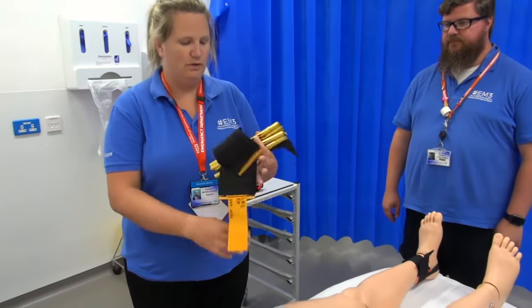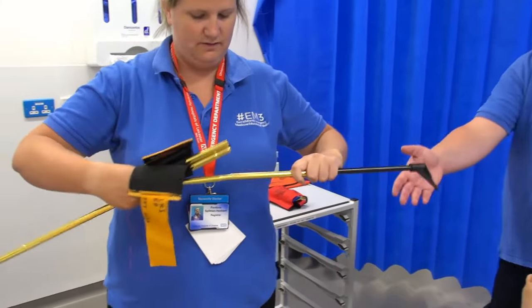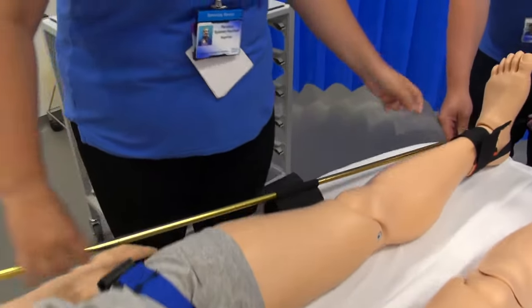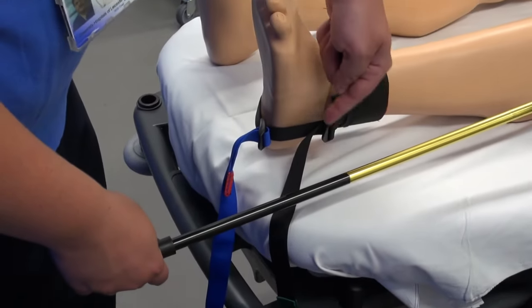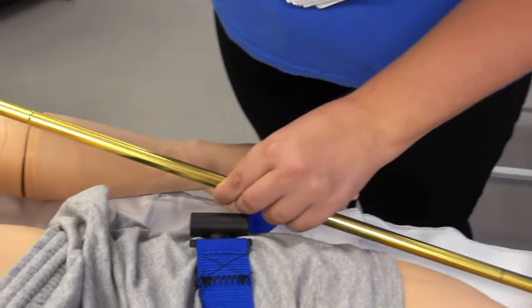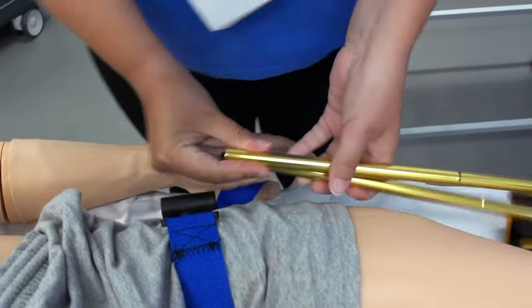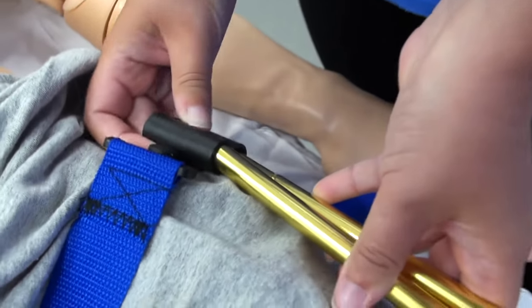Take the traction pole and extend it out. Measure it against the patient's leg — the black line on the pole should be level with the foot. Then shorten it to fit into the poles and pop it inside the holes on the thigh strap.